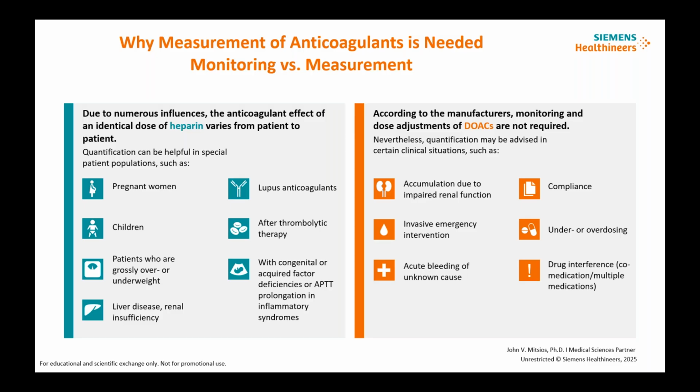Well, we need to be able to assess whether we need to administer an antidote or not to these patients who are coming to the ED, unclear as to what their anticoagulant status is, allowing us to properly assess and triage these patients appropriately to see whether or not the antidote will be useful in the context of the patient's anticoagulant status.